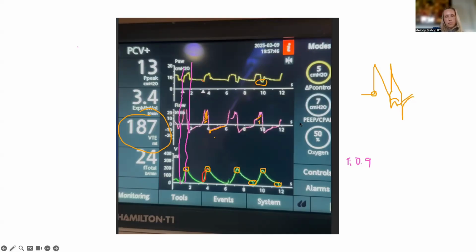And she's like, the patient's still double triggering. Like we need to do something about it. And I was like, that's a reverse trigger. And they are very adamant that they're double triggering and I needed to do something about it. And I'm like, I can't, it's a reverse trigger, I went through the whole thing.